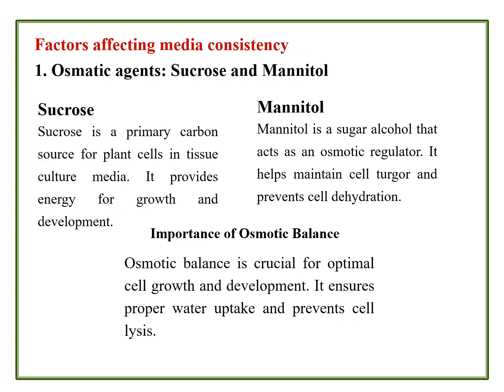Let us see what are the factors affecting media consistency. Some very important factors are osmotic agents, that is sucrose and mannitol. Sucrose generally acts as a primary carbon source for plant cells in plant tissue culture media preparation.